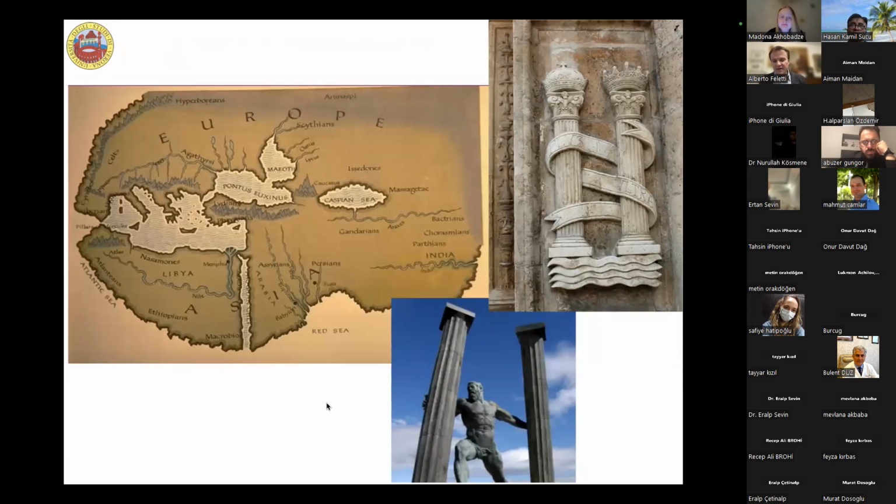When I think about the cerebral aqueduct and the fourth ventricle, I always think about ancient Greece. Why? Because the ancient Greeks thought that this was the world at that time. And they thought that there was a limit for navigation, which was called the Pillars of Hercules, which is actually the border between Spain and Morocco.